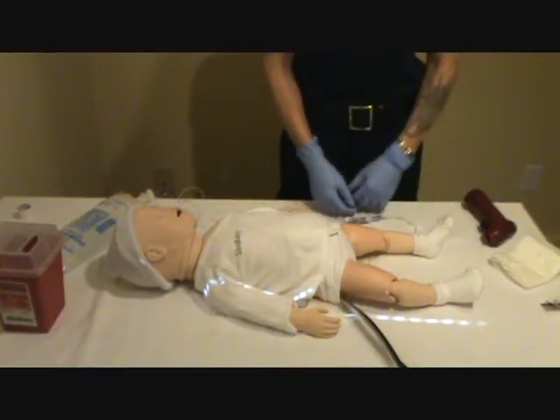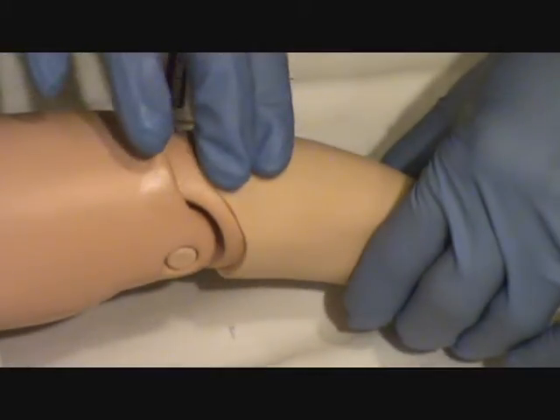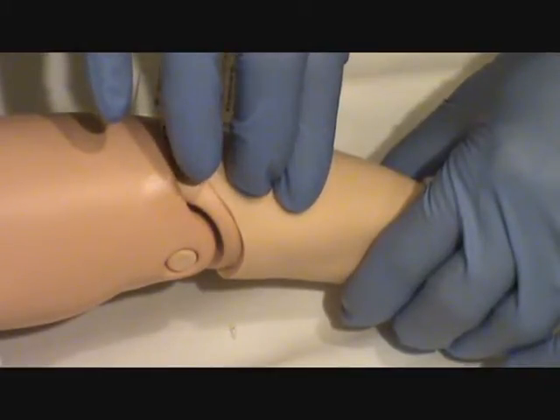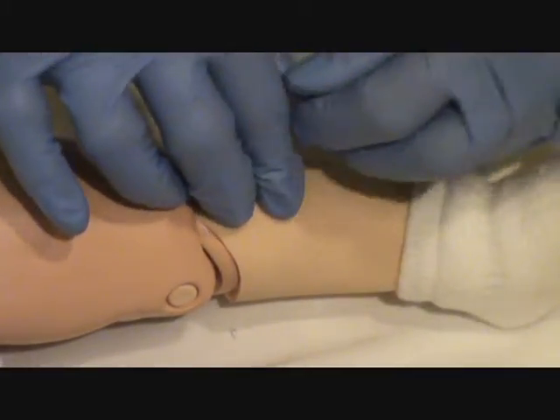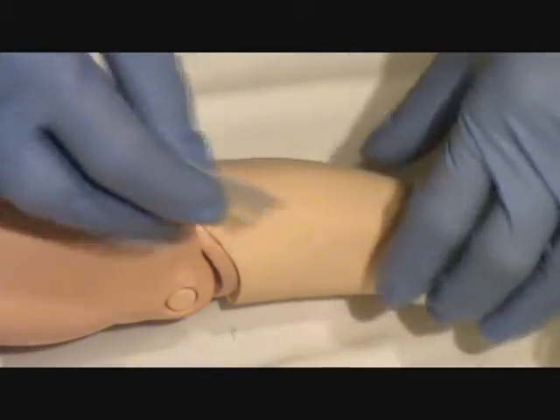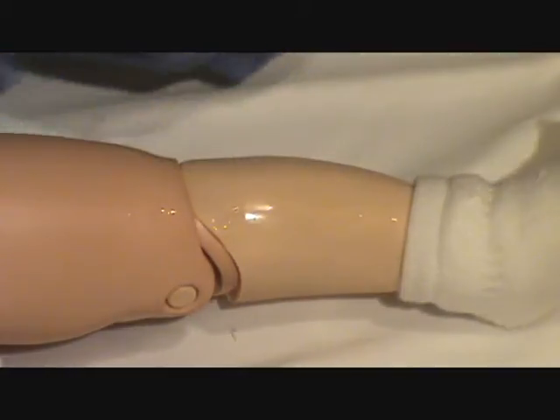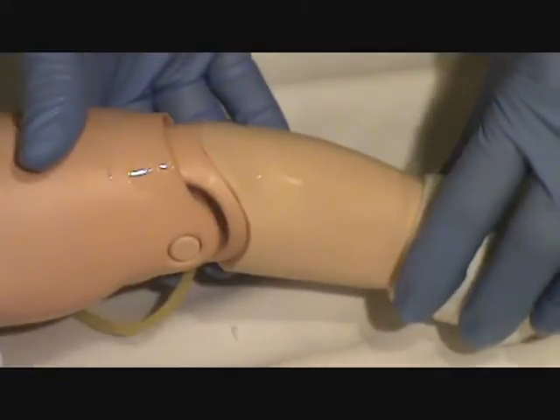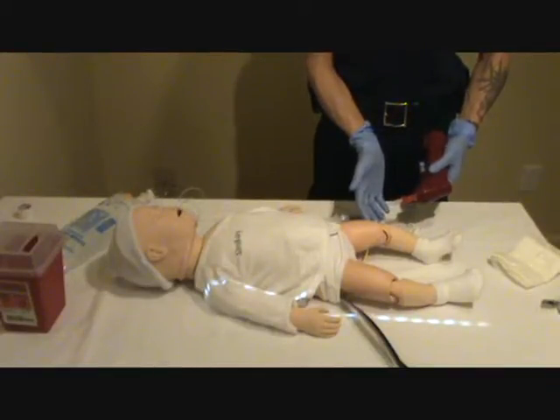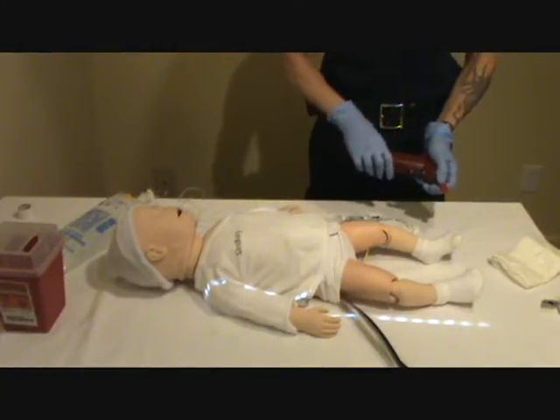The next step is to locate your landmarks on the patient. For our patient, we want to go 1 to 2 centimeters below the bump in the knee and to the medial side. Once we've selected our point, we want to clean it thoroughly. Then we want to prepare the EZ-IO needle and driver set. And the preparation is simple. Just place the EZ-IO needle set onto the driver set and it will attach using a simple magnet attachment. Then you want to remove the needle protector at the end of the IO set.